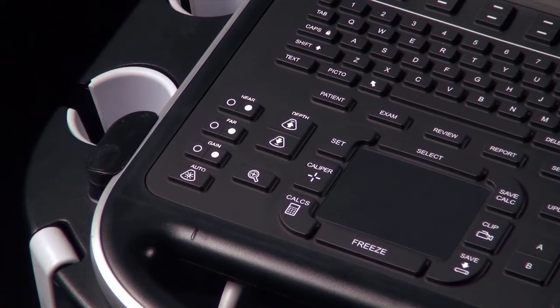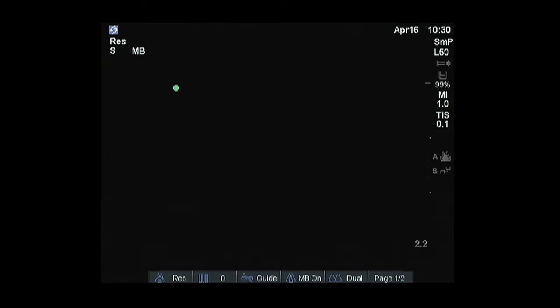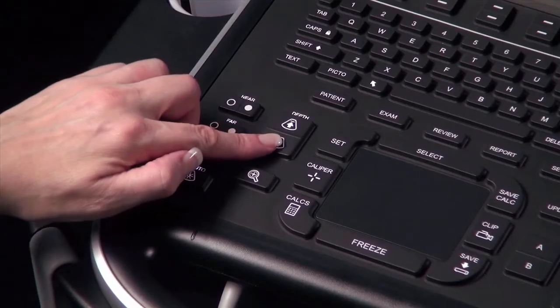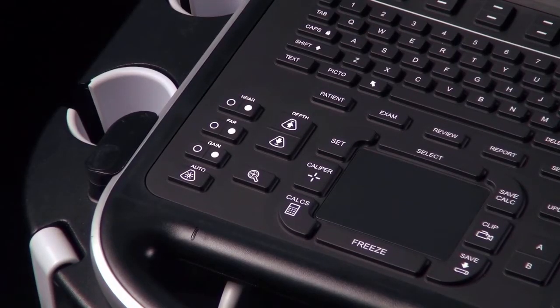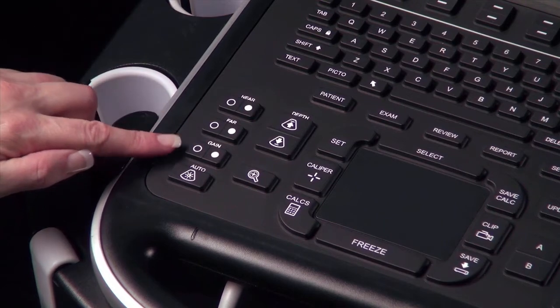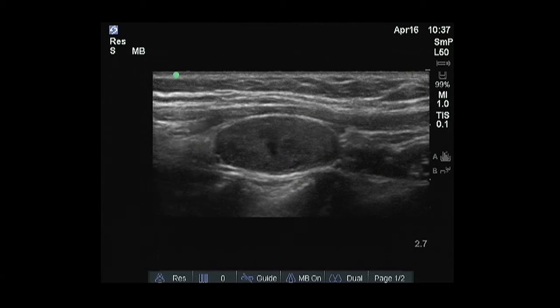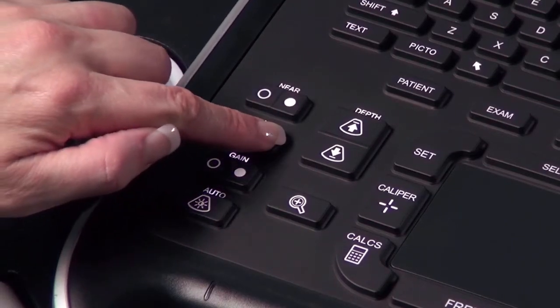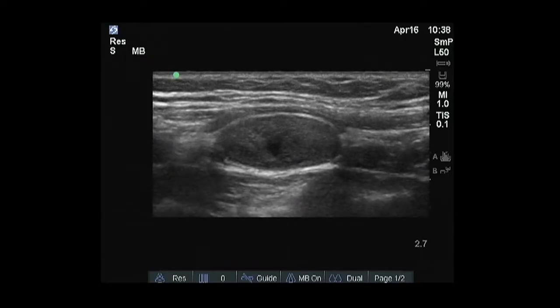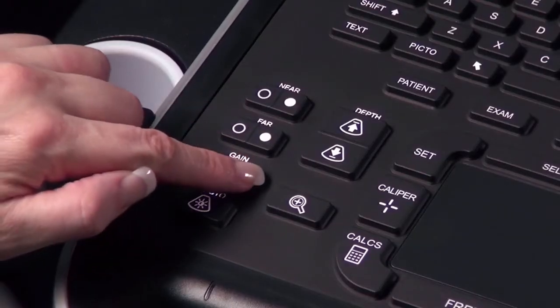There are two keys for adjustment of imaging depth. Depth up decreases imaging depth, and depth down increases imaging depth. On the left-hand side, there are three controls for gain compensation. Near adjusts the gain applied to the near field of the image. Far adjusts the gain applied to the far field. And gain adjusts the overall gain applied to the entire image.